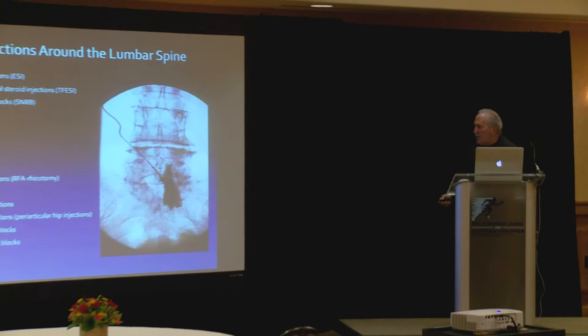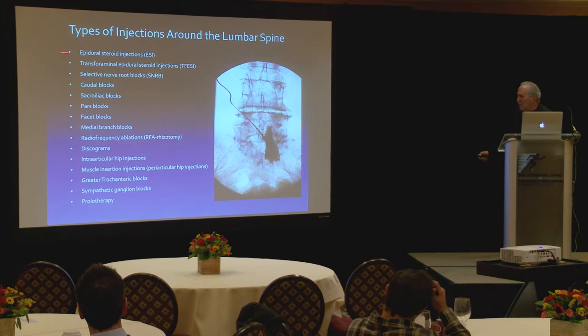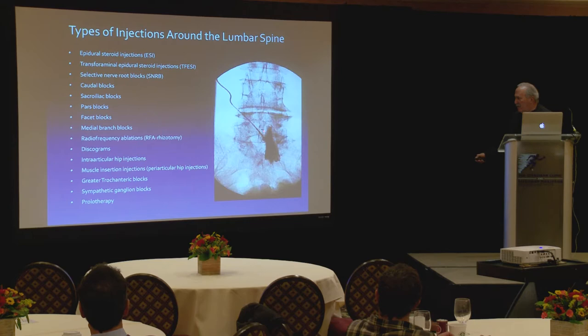So, epidural steroid injections are one of the things you can do. And you can fill up the canal on one side and bathe the nerve and the root and even a portion of the anterior facet. You can do a transforaminal epidural steroid injection where instead of filling the canal from here, you fill it from here. And sometimes you have to do that. If somebody's had prior surgery, there's no good anatomic landmarks here. Dr. Evans has to come from here.